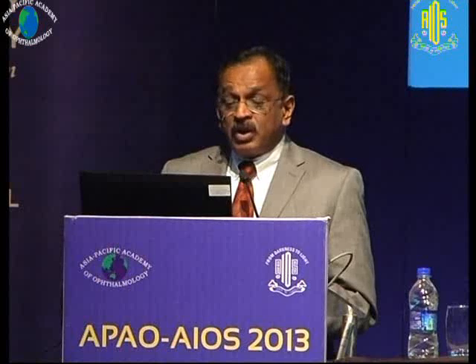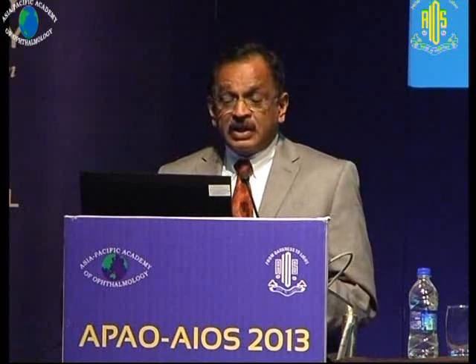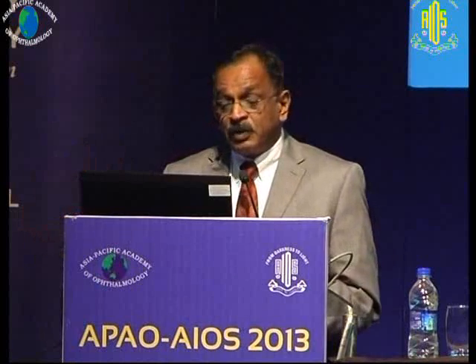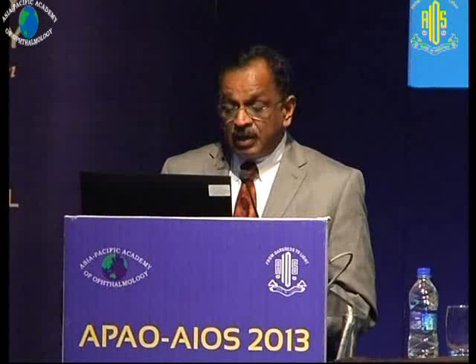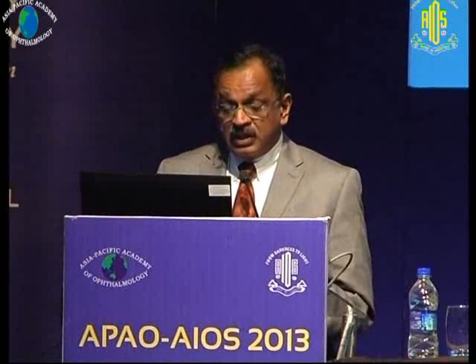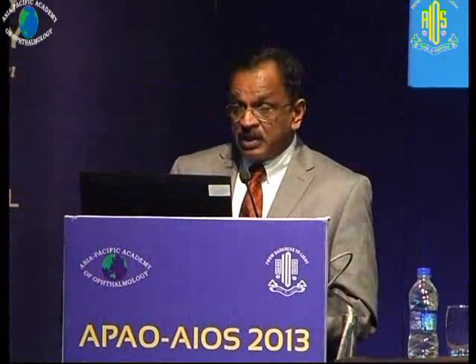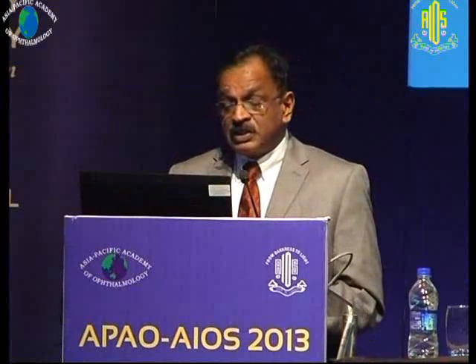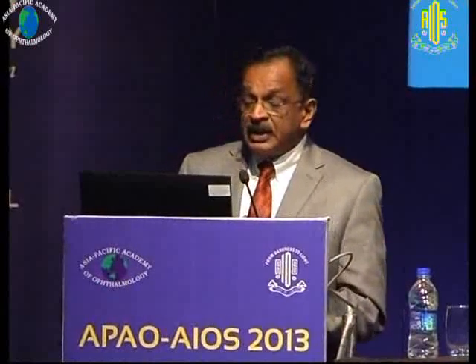Subretinal foreign body, posteriorly located and especially mobile foreign bodies, foreign body in detached retina need this approach, wherein you would have to go in and do a posterior retinectomy or retinotomy and remove the foreign body, and also you would have to do a laser photocoagulation surrounding this area in case this is a very large retinotomy that is made.